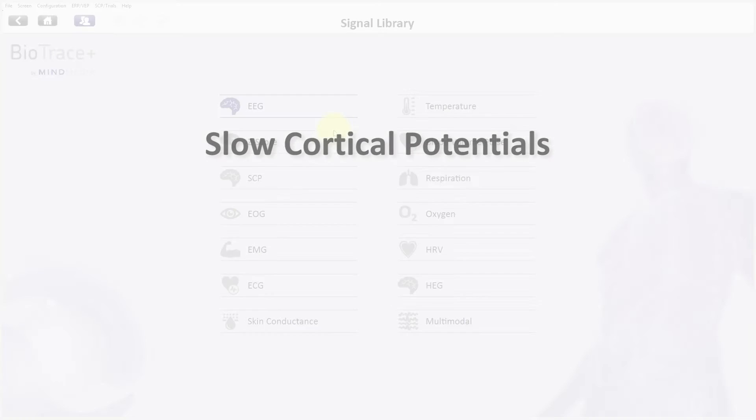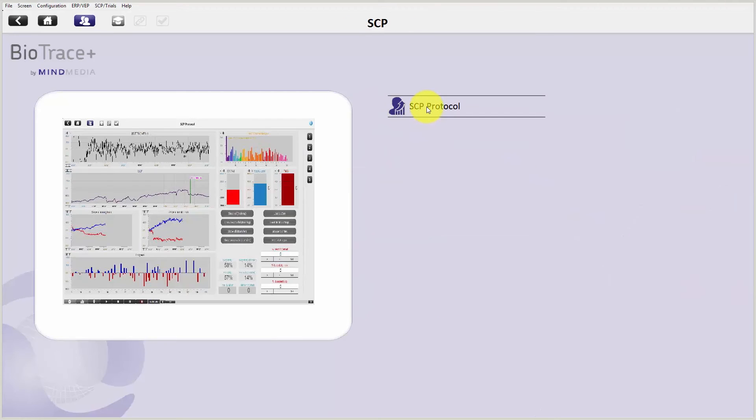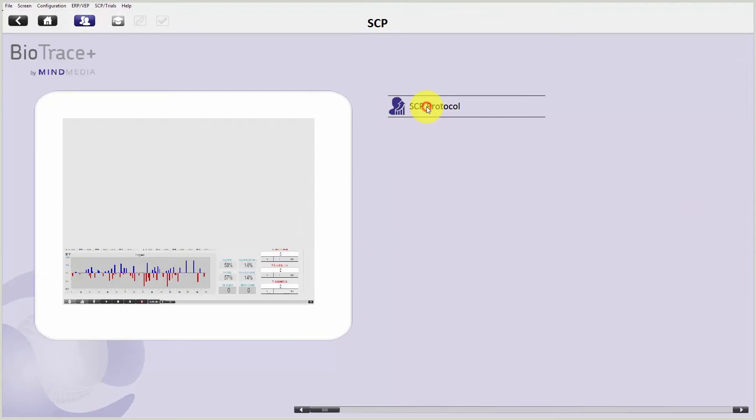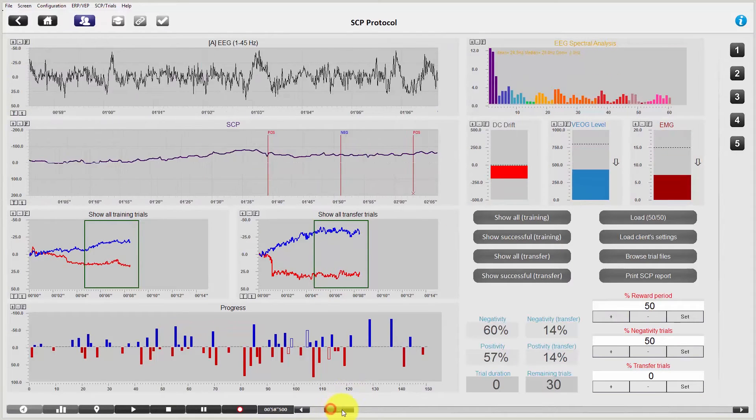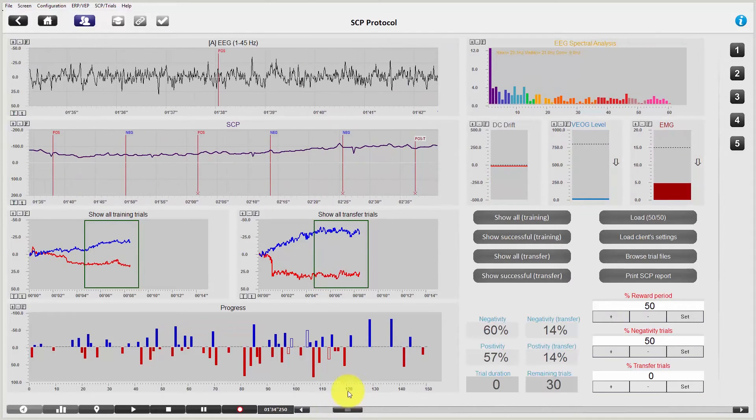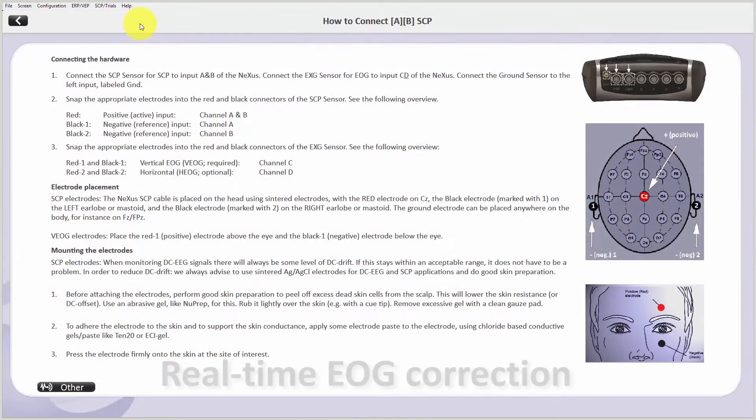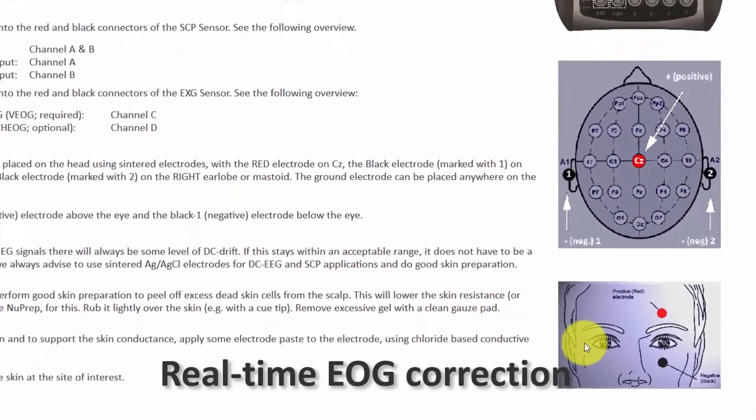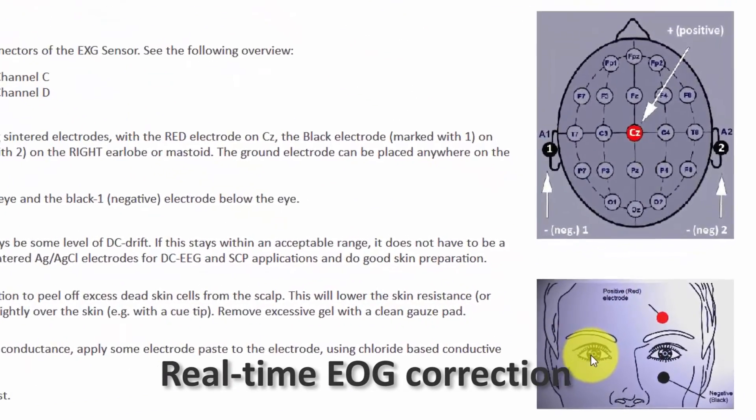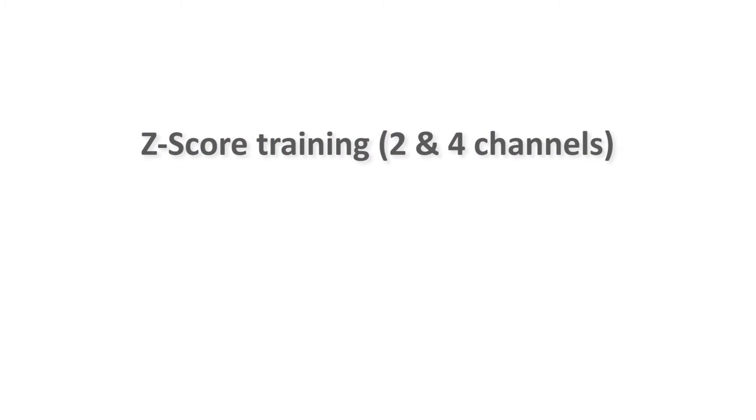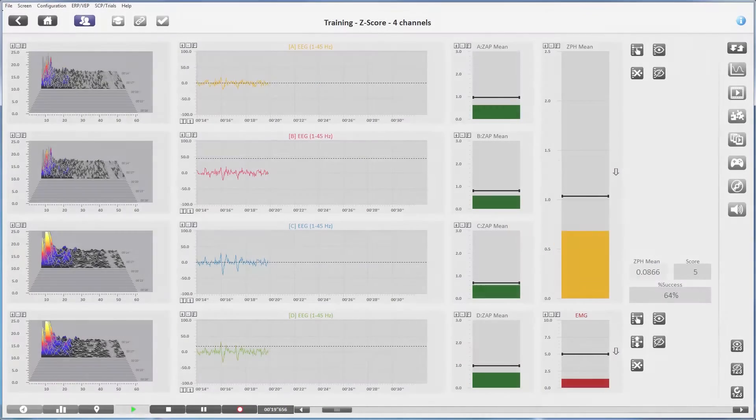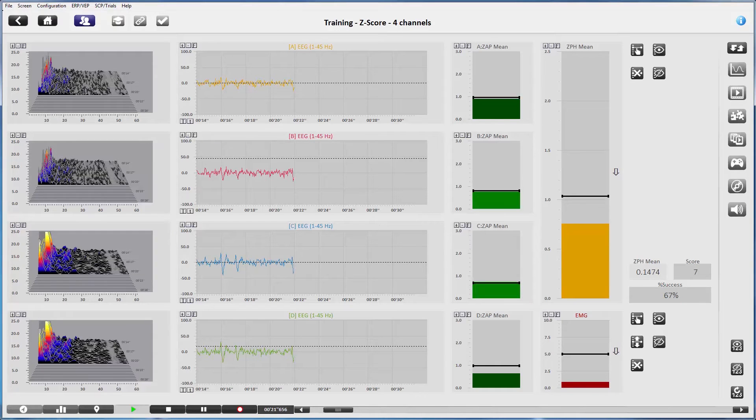In case you are interested in slow cortical potentials, the SCP protocol has been updated and made extremely flexible while also offering real-time EOG correction of the DC EEG signal. BioTrace Plus also supports two and four channel Z-score training based on a normative EEG database.